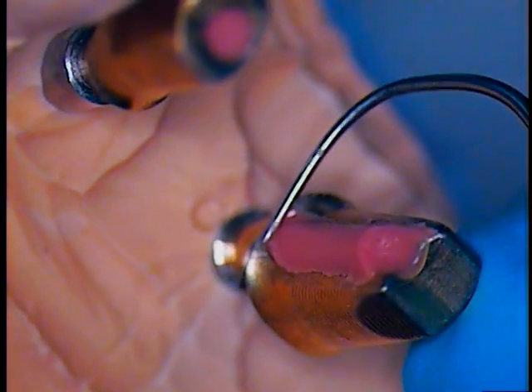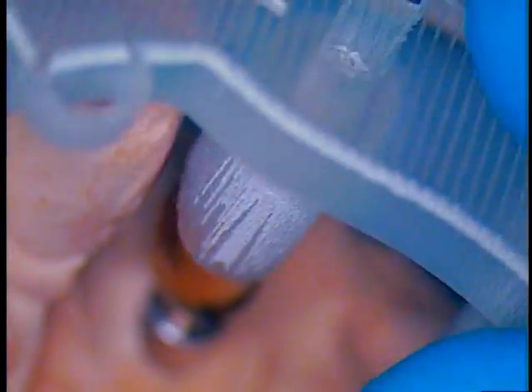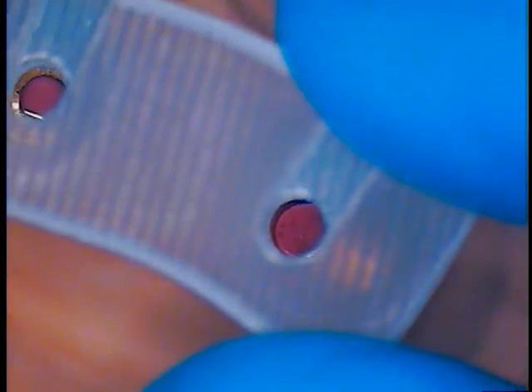So now the object of the game is to go ahead and try in the bridge, which is right here. Actually the jig — but we can try in the bridge again, and we want to try in the jig. Make sure the jig fits. I think we'll be fine with that. It doesn't really matter if you try the jig in — it's more about the bridge. Okay, so we're good to go. We're ready to seal things up and glue it in.